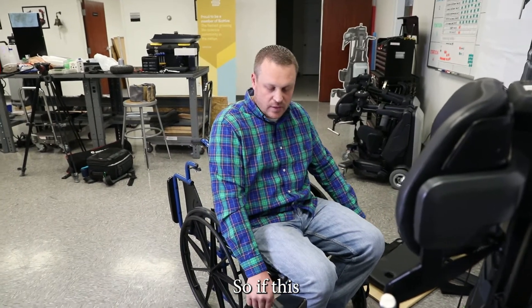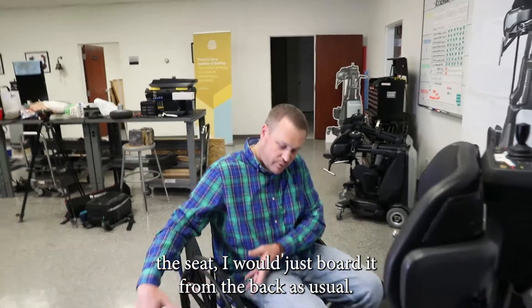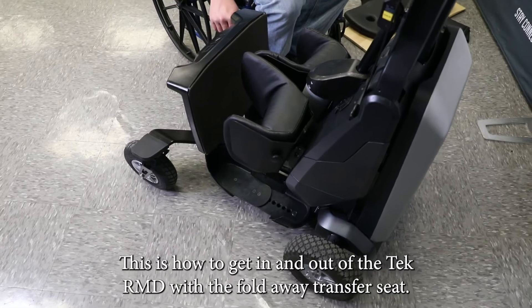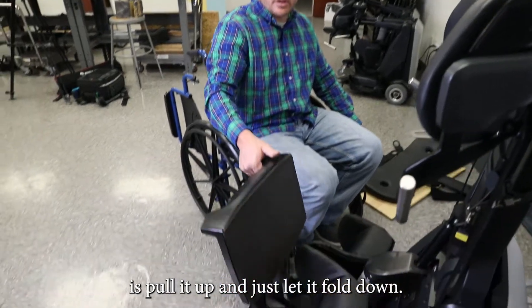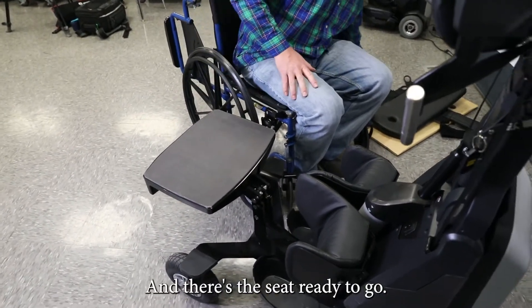If this device did not have the seat, I would just board it from the back as usual. This is how to get in and out of the TechRMD with the fold-away transfer seat. What I'm going to do is pull it up and just let it fold down — and there's the seat, ready to go.